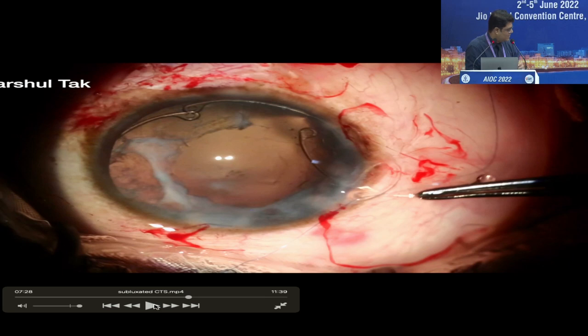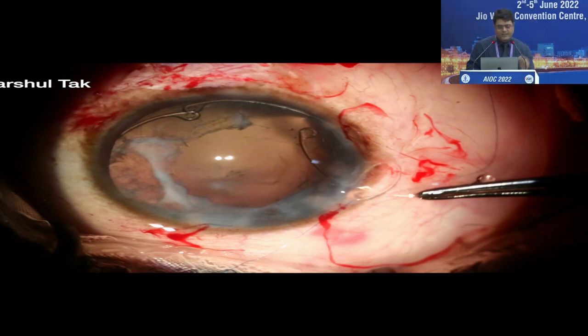device nowadays? CT segment is actually a lot easier, because trying to dial that whole thing with the suture, sometimes there's entanglement. It creates a mess. So this is actually a much better option in my hands. And in fact, I've stopped using suture also. Now I just use the 5-0 prolene, and I create that little thing like Yamane. Yes. So it works very well. So you don't need to put it with the suture in. Yes. You can thread it later. Yes. So this CT segment has an eyelet, which needs to come over the anterior capsule.